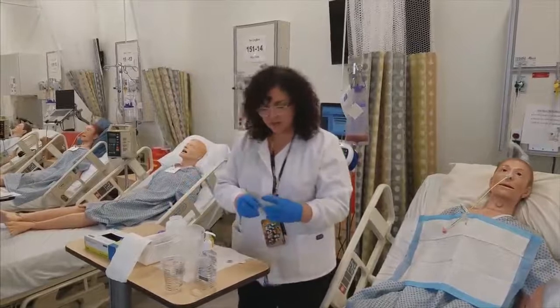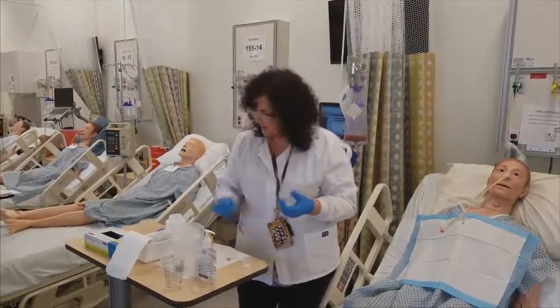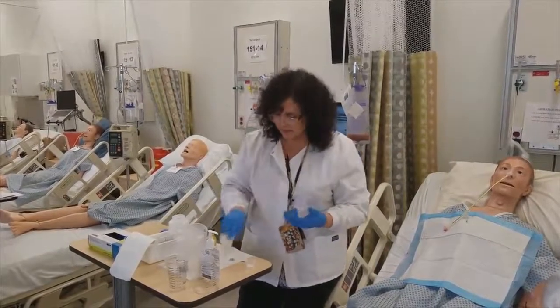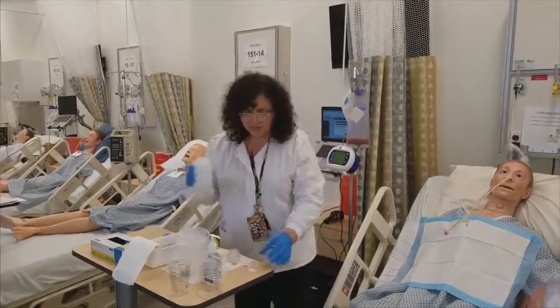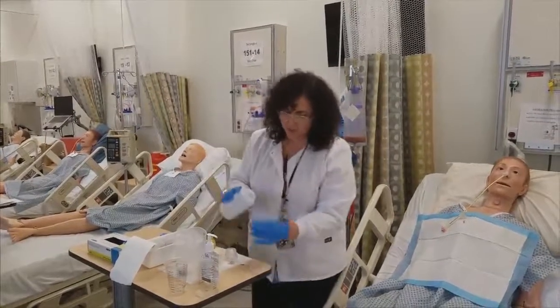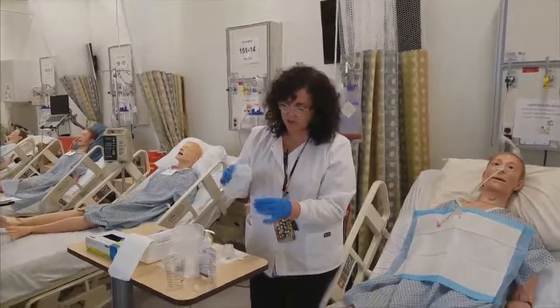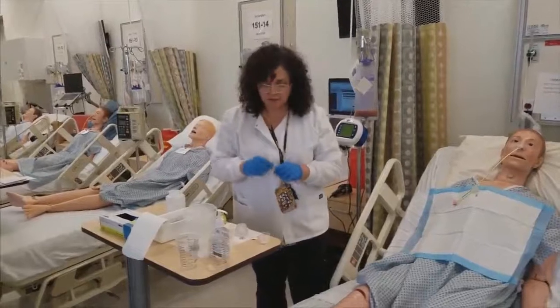And then I'm going to transfer the powder to a cup. Now I could use this cup. Actually, this cup is nice to use as well because it's a little bigger, gives me more opportunity to stir. And then I'm going to use tepid water. I'm going to pour it in maybe about 20 mils, and then I'll top off to a total of 30 milliliters.